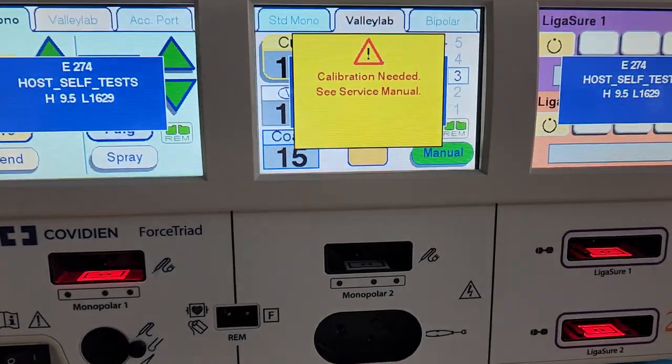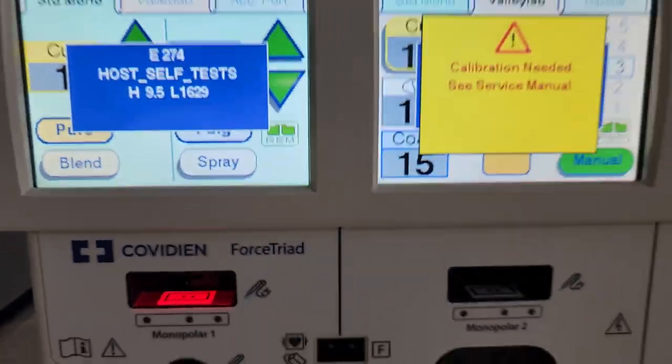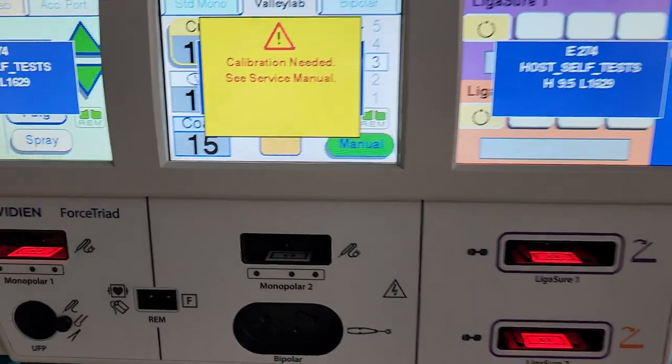Right here is the force triad, and you can see it says calibration needed. It's got E274, which means it lost its calibration values. Why did it lose its calibration values?